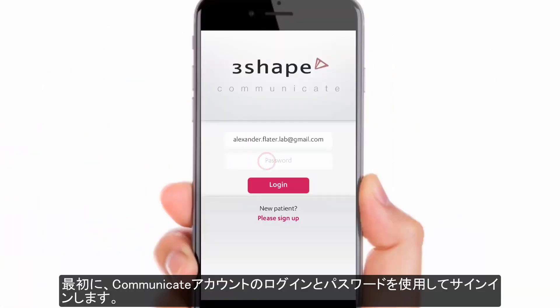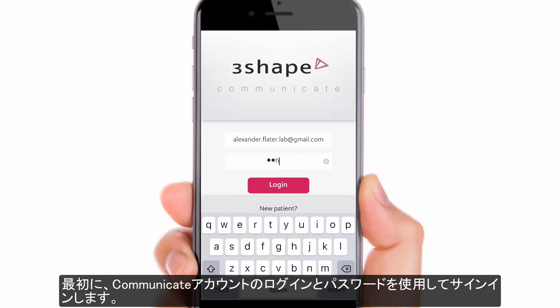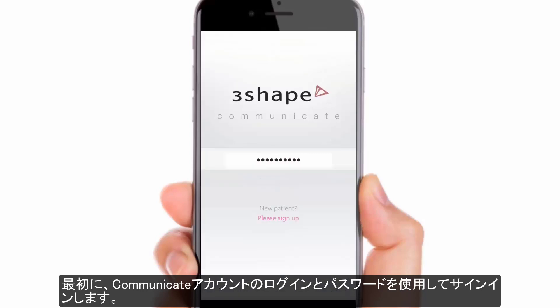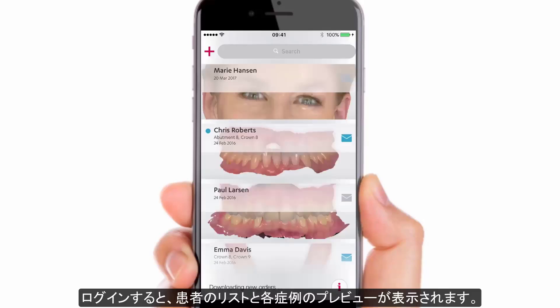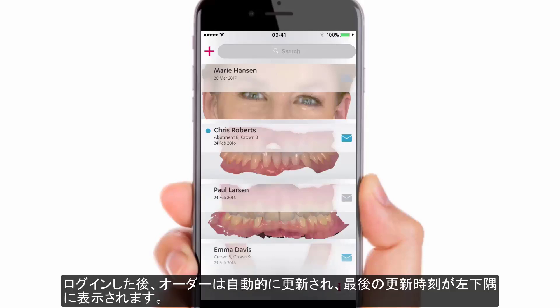Start by logging into the application using your 3Shape Communicate login and password. Once you have logged in, the list of patients with cases and a preview of each case will be visible. After logging in, orders will be updated automatically, and the time of the last update can be found in the lower left corner.